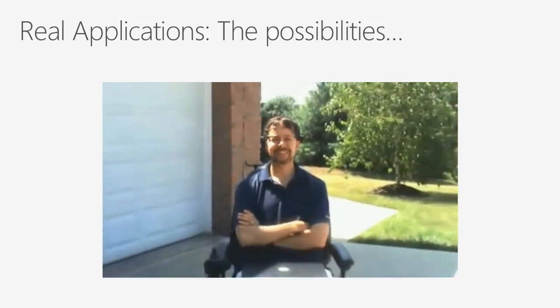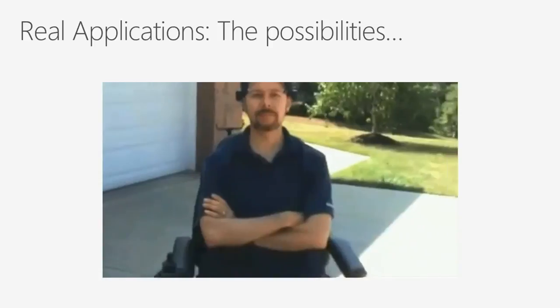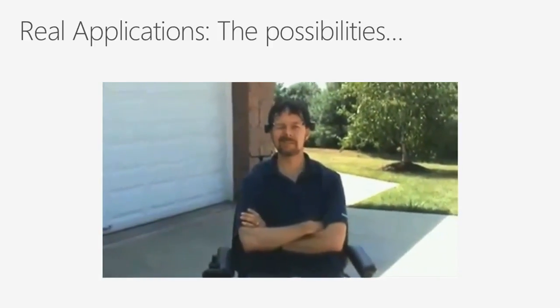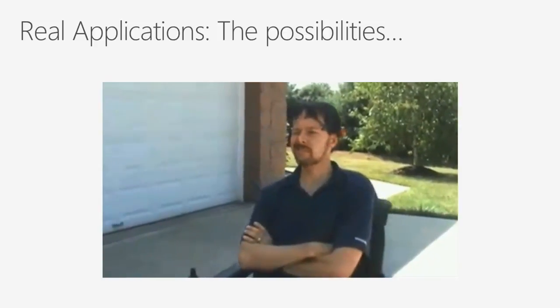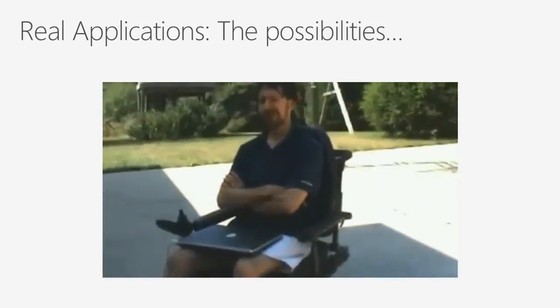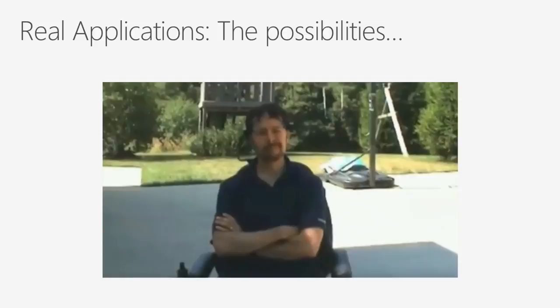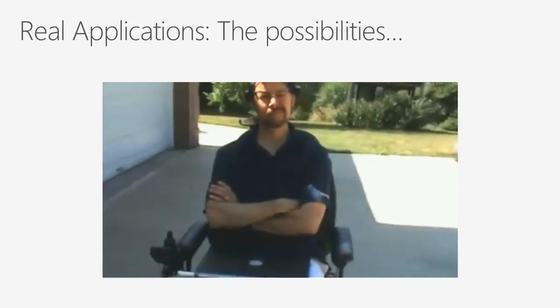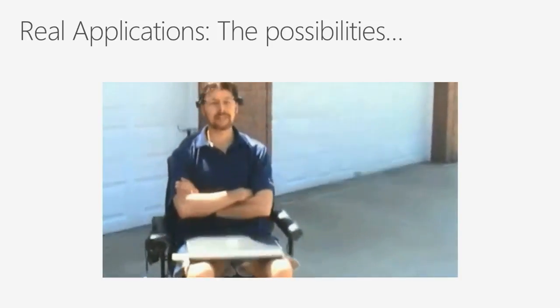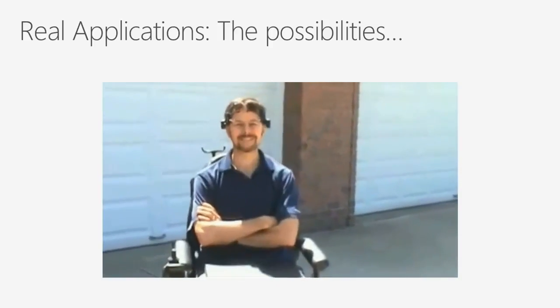And finally, to real life-changing applications, such as being able to control an electric wheelchair. In this example, facial expressions are matched to the movement command. Now blink right to go right. Now blink left, turn back left. Now smile to go straight.